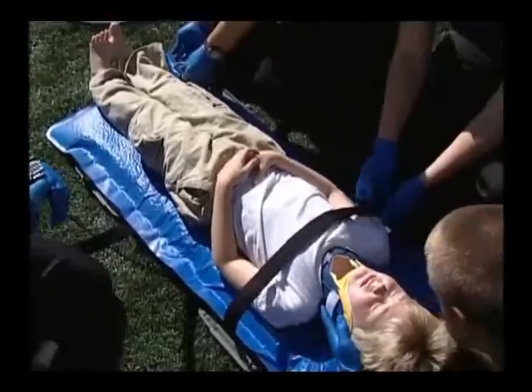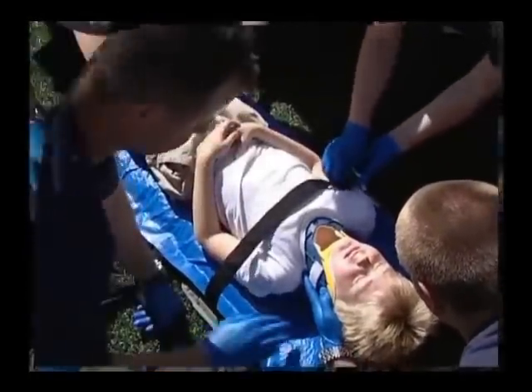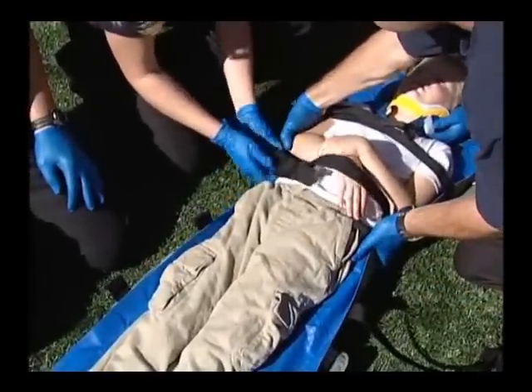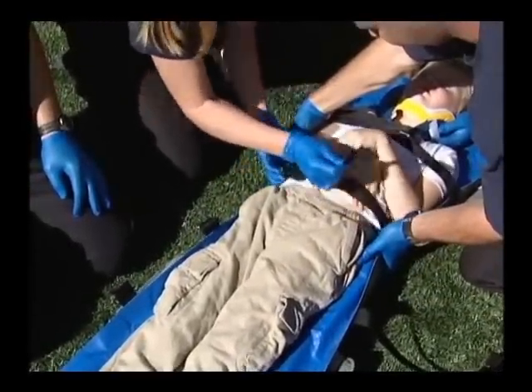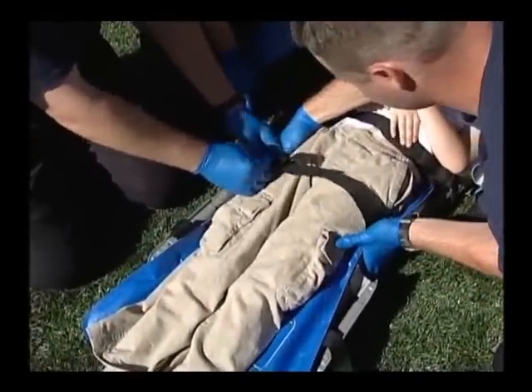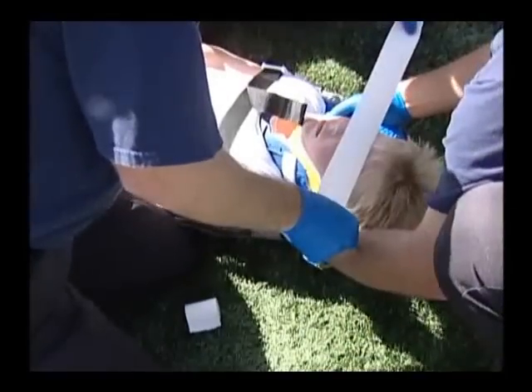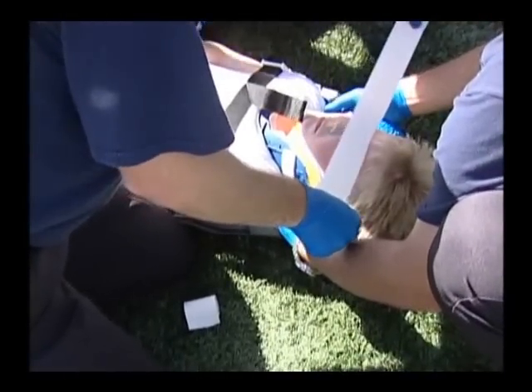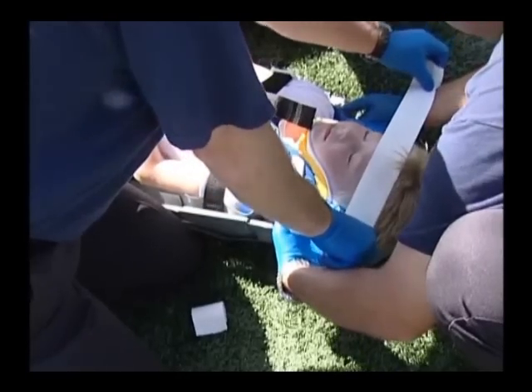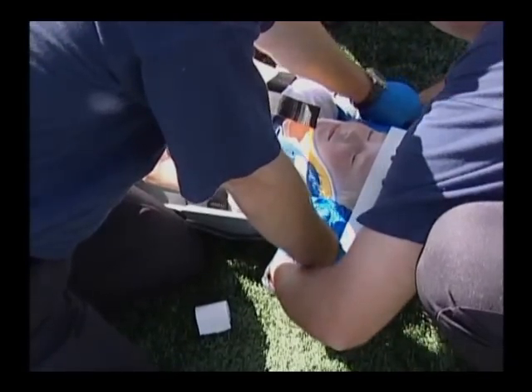The straps of the pediatric mattress come straight across the patient and do not zigzag down the patient. This also allows an individual strap to be unfastened while keeping the other straps secured, which could be beneficial for physicians that need to examine a particular area of the child while still keeping the child securely immobilized. Use of a rigid cervical collar should be a decision made by your local medical director. Medical-grade adhesive tape, either 1-inch or 2-inch in width, can be used to secure the forehead of the patient in the vacuum mattress.